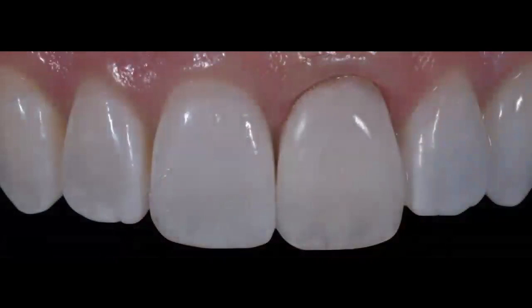And you can see here, this is immediately after. Of course, it's not a good time for us to evaluate the value of the restoration, but you can see that we've been able to recreate not only the shape and form of tooth number 8, but we have the same gingival height of contour and the same halo effect on the incisal edge.